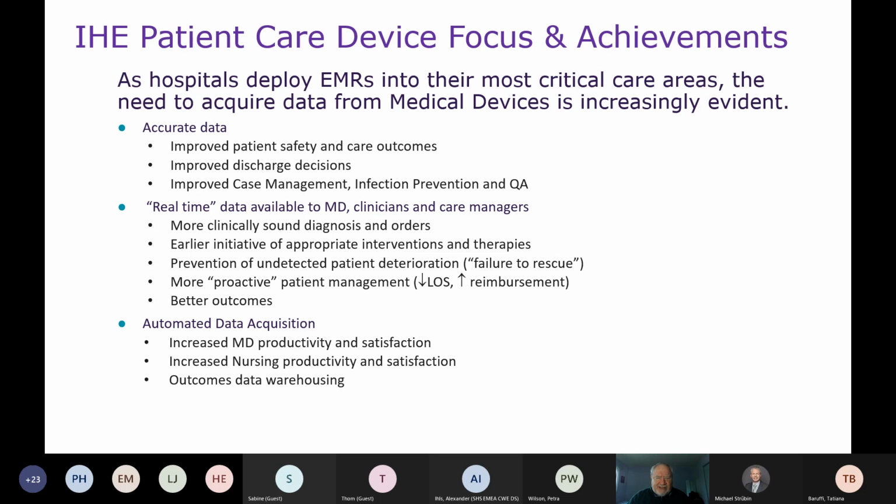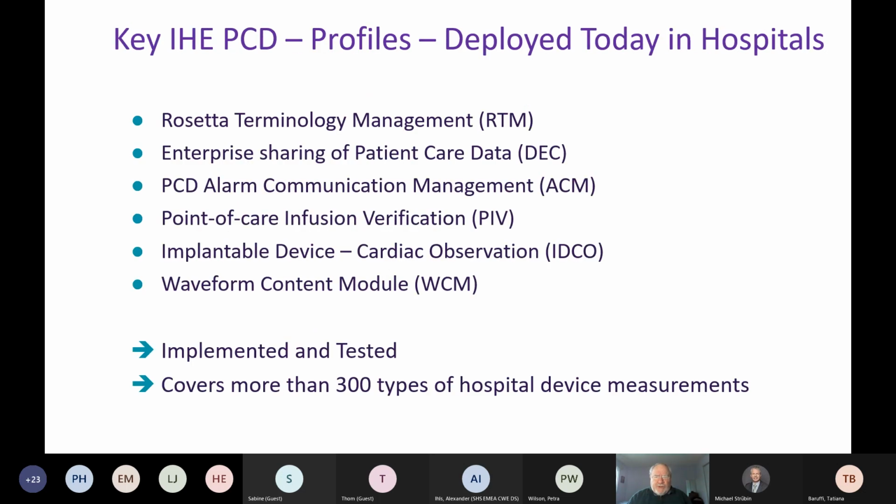Some of you are in those markets. Next slide. So the key profiles, this is not the complete list, but those are the most widely adopted and recognized profiles for device integration in hospital. I will speak to the first two a little bit deeper to give you a sense, but I encourage you to access the IHE technical framework, the patient care device technical framework, on the IHE website, to understand better what those other profiles are. All of those are implemented, they are tested, they have testing tools, and they are broad. The enterprise sharing of patient care data covers way more than 300 types of hospital device measurement in a standardized way, and I will explain to you how this works. Next.